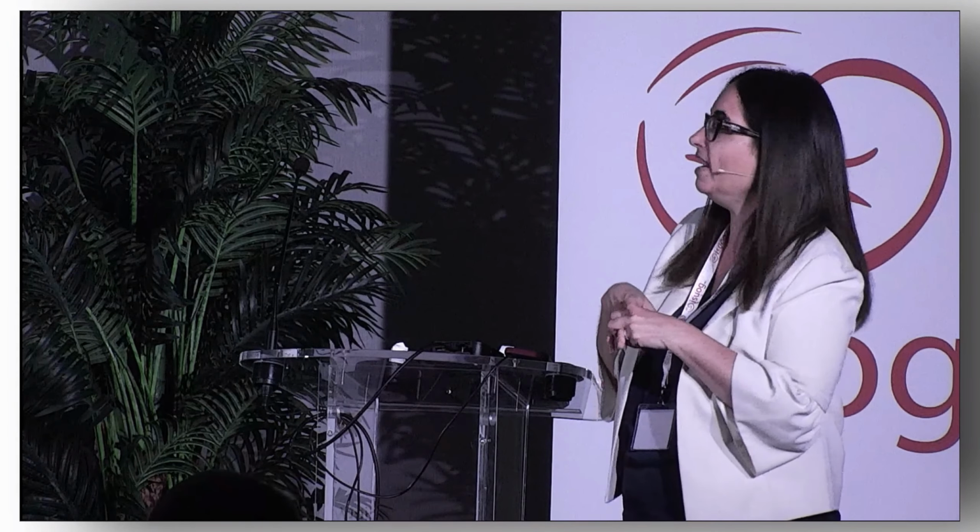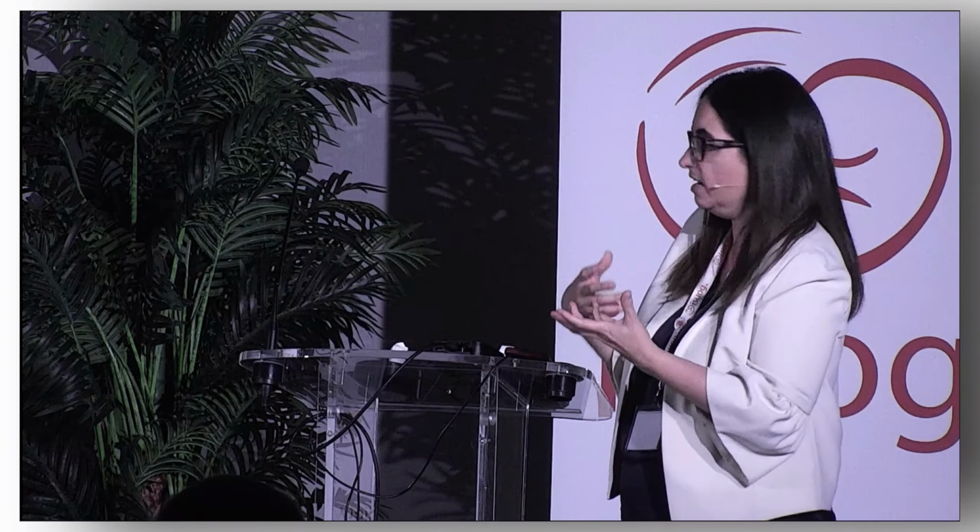But I think it's important to keep on training ourselves to spend time on improving the image, because it's really worth it and really important. And I think that when you are used to losing time improving the settings, you get so used to it that you do it super fast, and at the end you don't lose that much time.